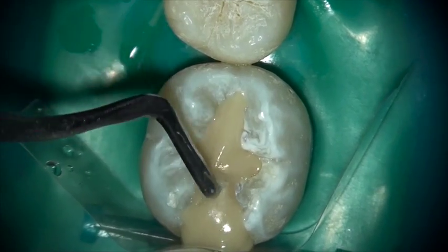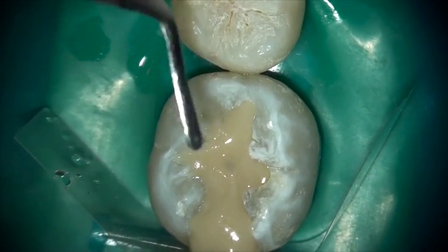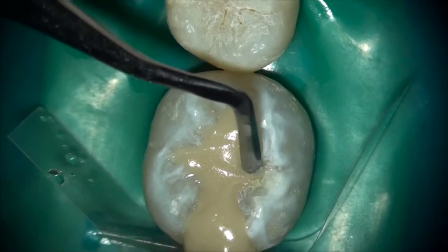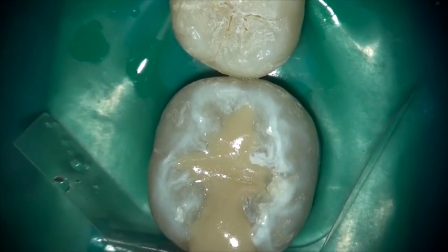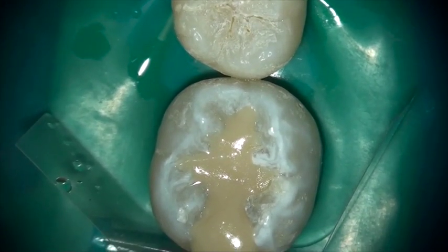Once placed in the tooth, use your favorite instruments to simply adapt it to the marginal walls and do your initial sculpting of the material. Its firmness and consistency is ideal for pre-sculpting while the material is setting.